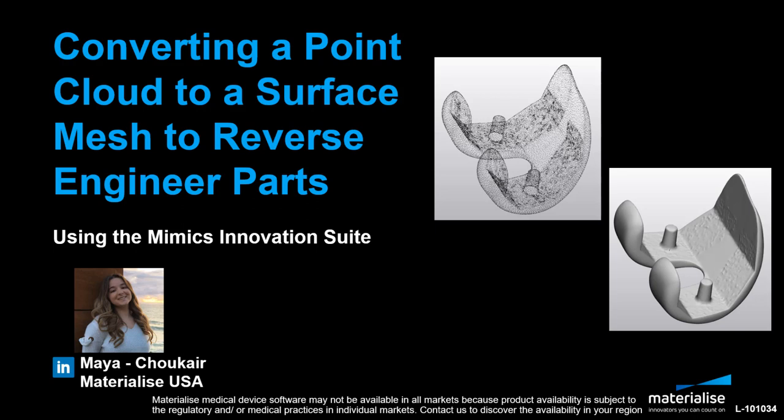This is especially helpful if, for example, you have a physical device or a part that you'd like to work off of virtually in 3MATIC. People will typically scan that physical device using an optical scanner and get a point cloud file as a result.